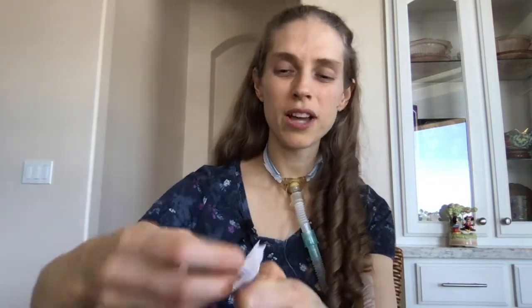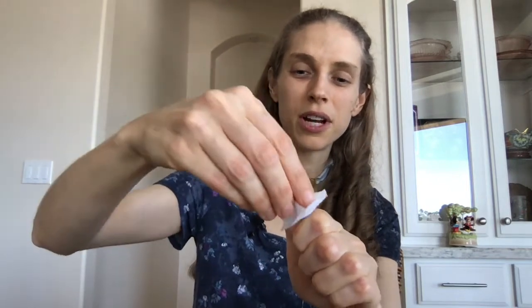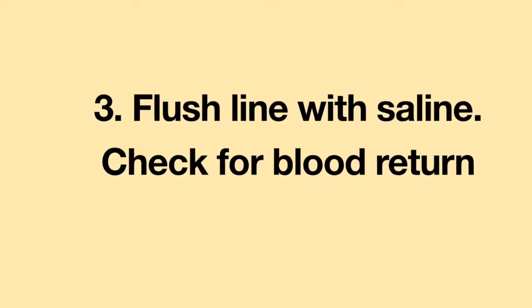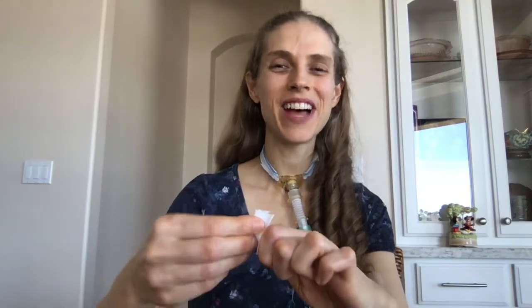Once you have a nice tight grip and have taken off the cap, you're going to disinfect the end of your line. Open the alcohol swab using your free fingers, take out the swab, and scrub the end of the line for approximately 30 seconds — really scrubbing the top opening. Once done disinfecting, discard the alcohol swab. Be careful not to touch anything to the top of the line; it is now sterile.